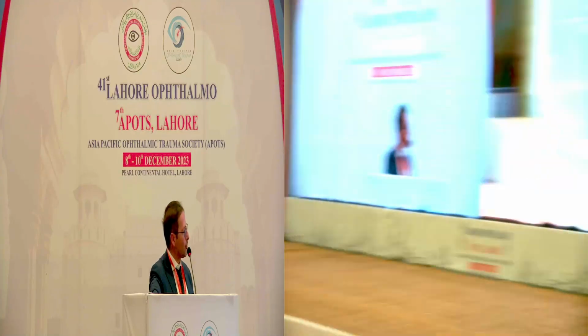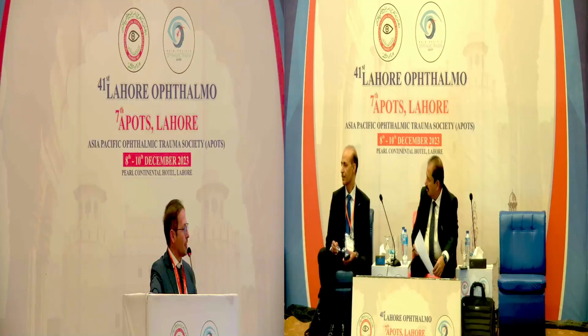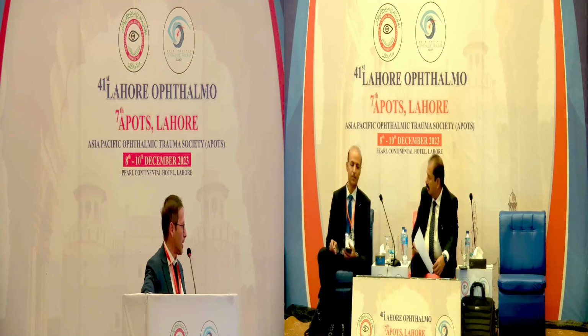So my only advice is to do a gentle hydrodissection, move the nucleus to allow the gas to go anteriorly, depressurize the posterior capsule, and then go ahead. Then it's a very easy way to do cataract surgery.